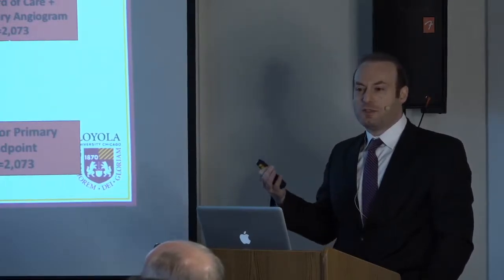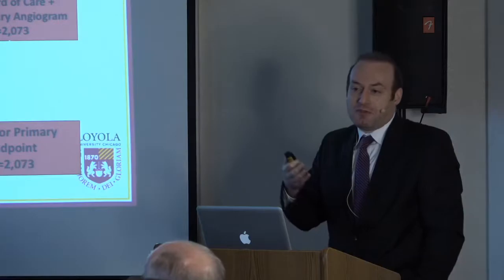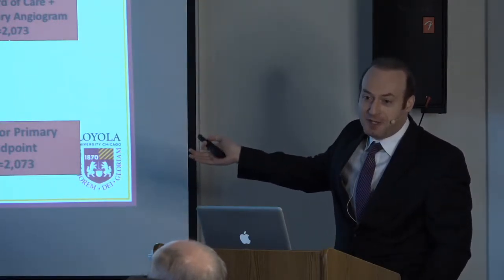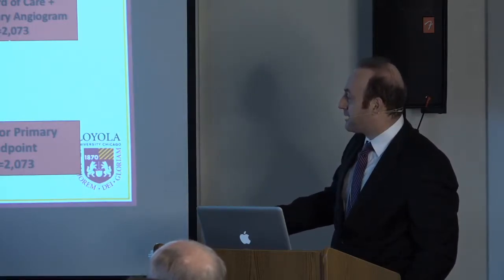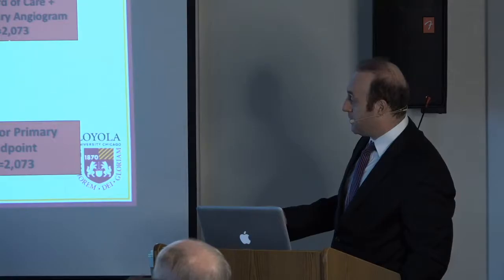And you could argue if these patients are symptomatic with suspected coronary artery disease, do you even need to do the calcium score? Can you go straight to the CTA, especially if you're doing CTAs on patients with CAC scores up to 9,000? So you could have even reduced that number by 37%.